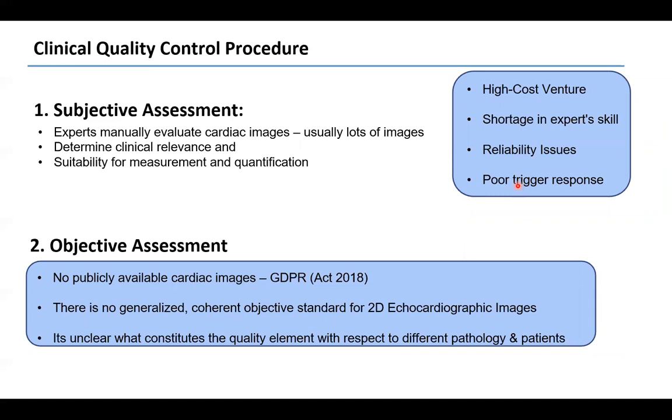The subjective assessment procedure allows the expert to evaluate each cardiac image and determine its clinical relevance and suitability for measurements. This process in turn is a high-cost venture, and it places pressure where scarce expert skill is required.